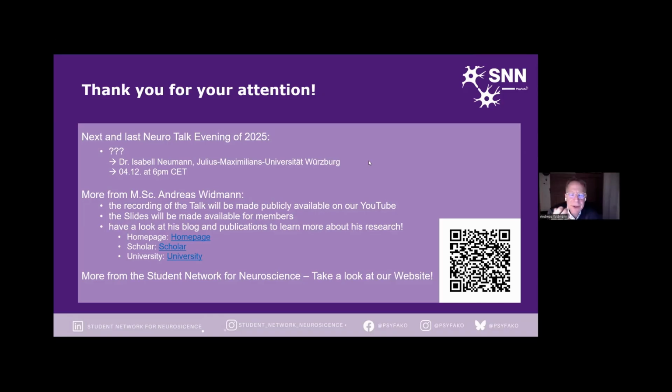It really depends. For example, we also have noise from MRI or from tDCS or other electric stimulation, which we can model and subtract. That is not spectral filtering, but also filtering, and it would be better than interpolation. If there is no other way to save the data, of course it's fine, but frequency-wise it's not necessarily optimal. You cannot easily do a frequency analysis of an interpolated signal, because you removed those parts. So there is no general answer. There are very many specifics the correct answer depends on.